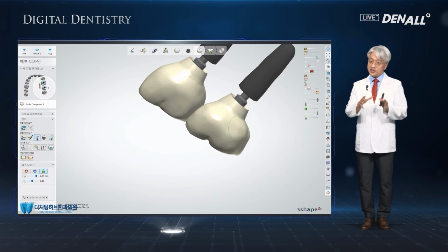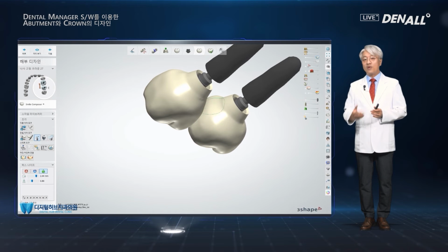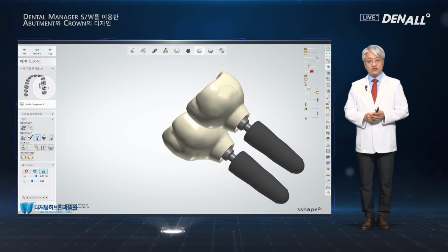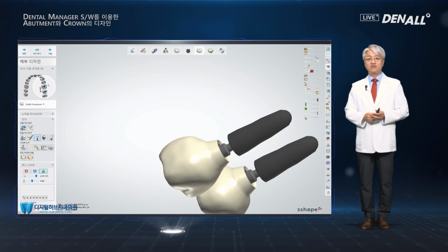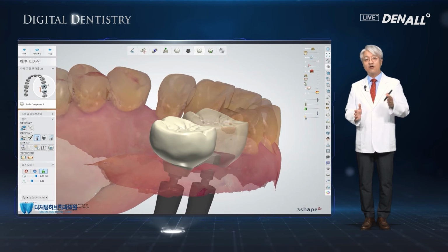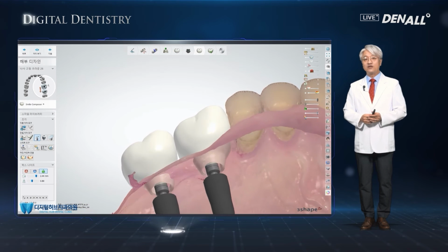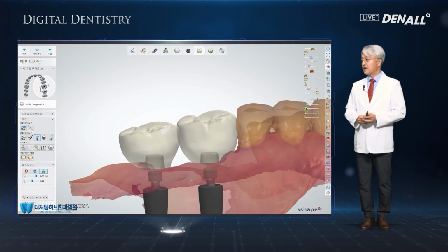You need to use the software skillfully in order to minimize the time spent at chairside in front of a patient. It will give you time saving, as well as the patient who has to be subjected to painful treatment. So from the clinic, surgeon, and patient's perspective, this is a very helpful solution.